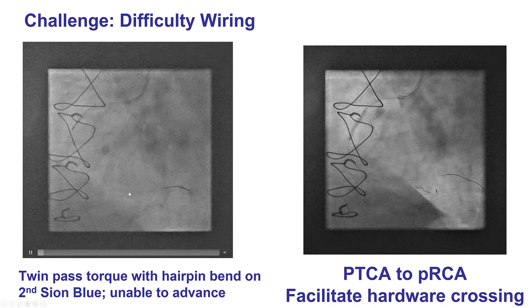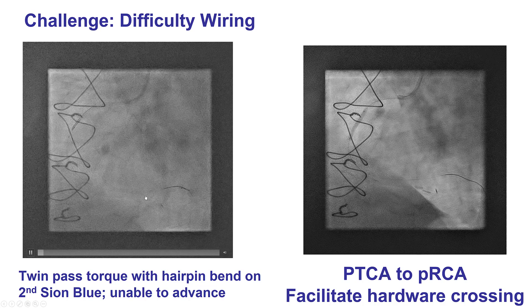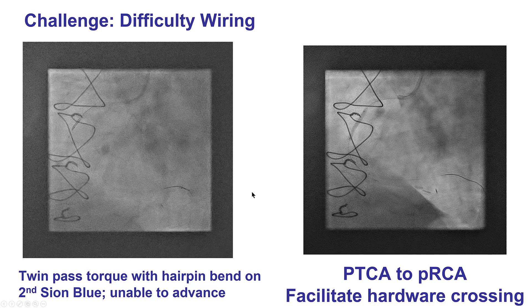When this problem happens, one option is to use a microcatheter; another is to use a polymer-jacketed wire. Another option is to use the hairpin technique or reverse guidewire technique, in which a hairpin is formed, usually on a polymer-jacketed wire like a Fielder FC or a Sion Black. This is advanced through the dual-lumen microcatheter all the way past the origin of the target vessel, and then when the wire is pulled back, it unfolds and enters into the PDA. Unfortunately, this did not work in this particular case.